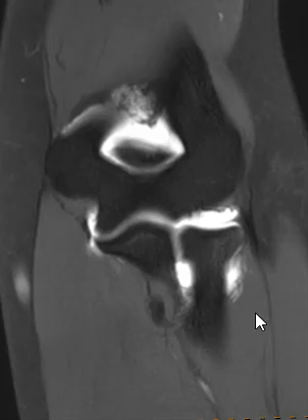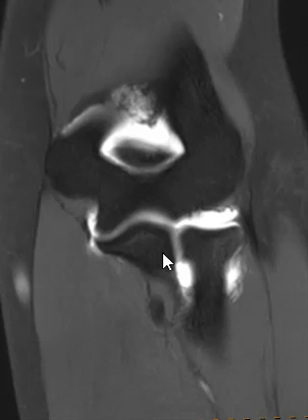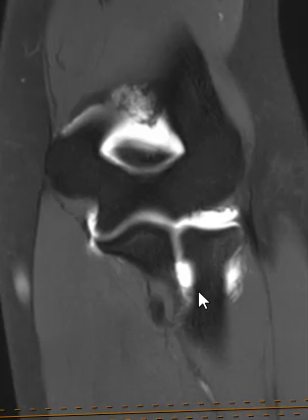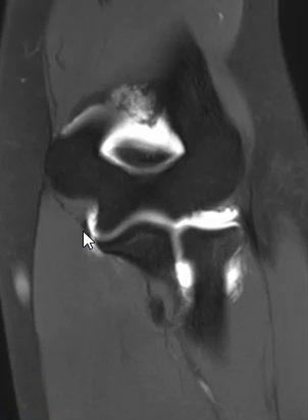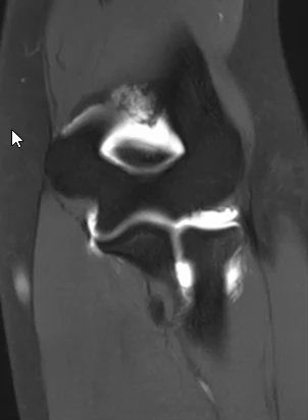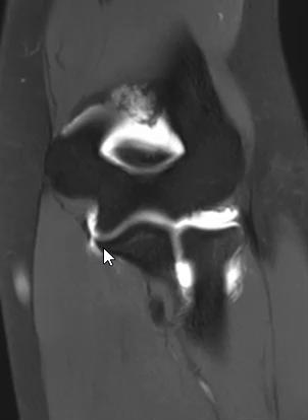Most often I see this right at the attachment to the sublime tubercle. I have several examples in other videos, but more is better, so here we go. This is the UCL coming down here on the medial side of the elbow, and this pointy part of the ulna is called the sublime tubercle.